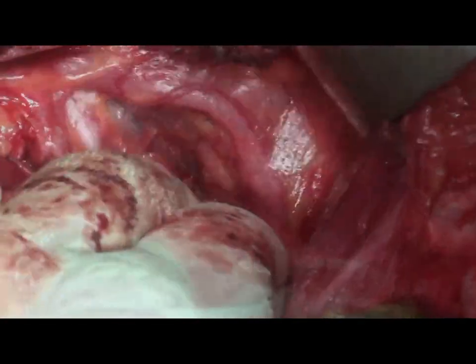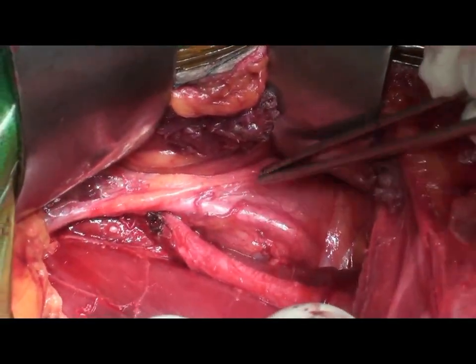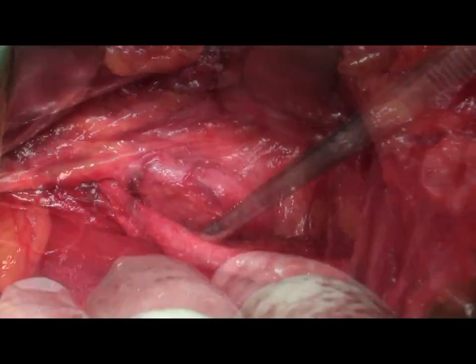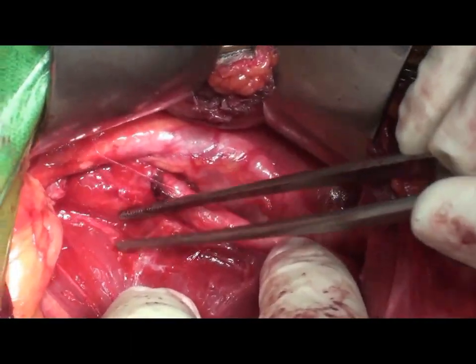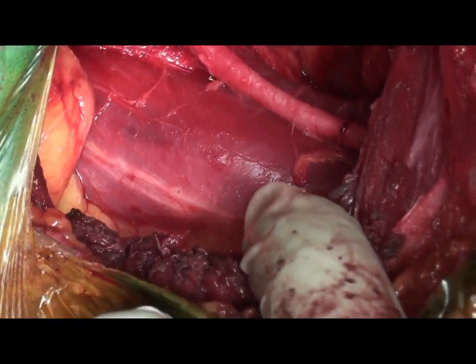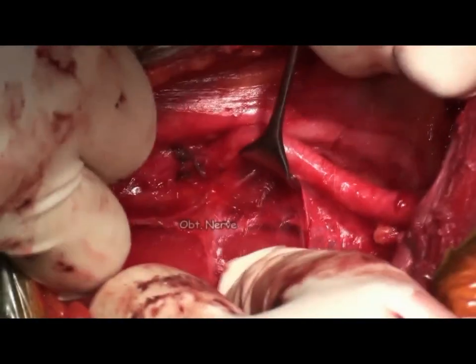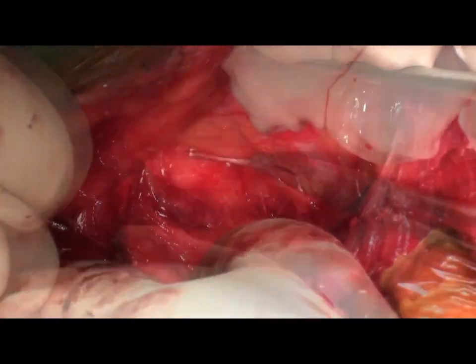The depth of dissection is the obturator nerve. The entire iliac lymph node groups have been removed. One can clearly see the ureter again, the external iliac artery, the internal iliac artery noted earlier, and the iliac vein in the depth. The obturator nerve is the deep limit of dissection. The lateral limit is the genitofemoral nerve. The lymphovascular tissue is dissected from above downwards using traction and counter-traction; any vascular structure is coagulated, ligated, or clipped. All lymphovascular tissue is traced downwards towards the inguinal ligament, where we had left the inguinal dissection. One can tunnel the lymph nodes either way to complete the dissection.